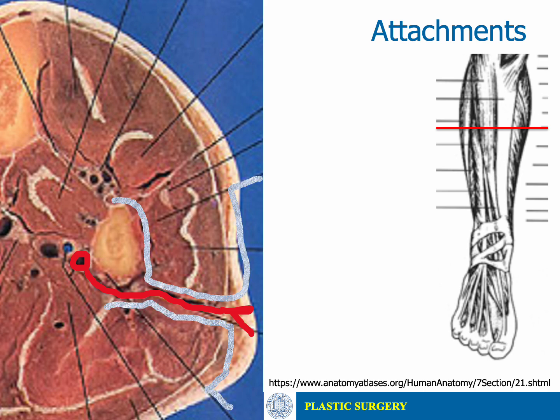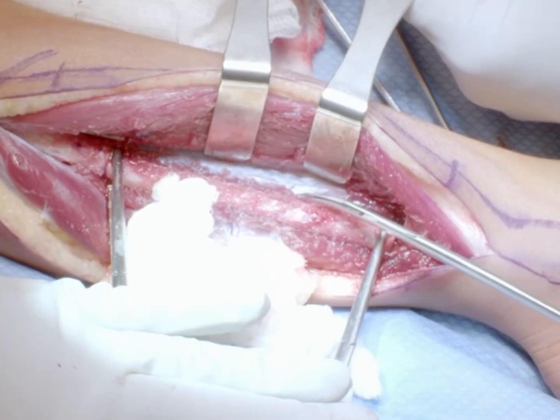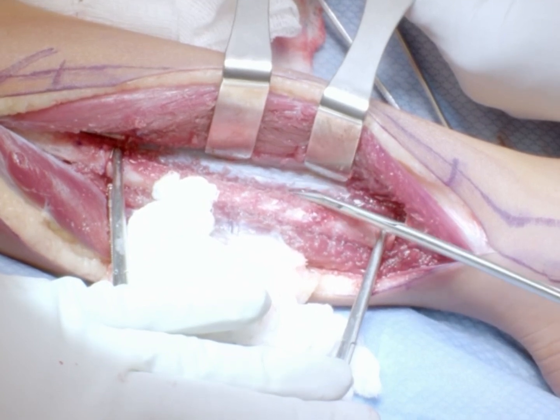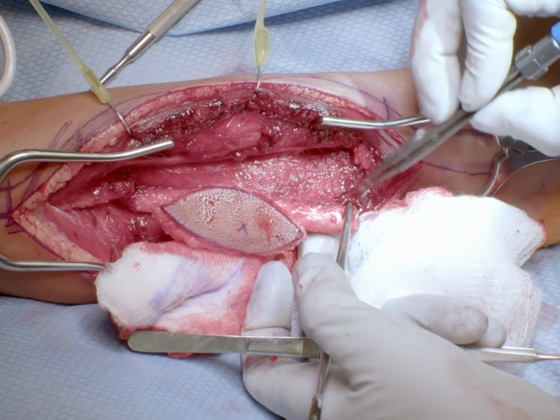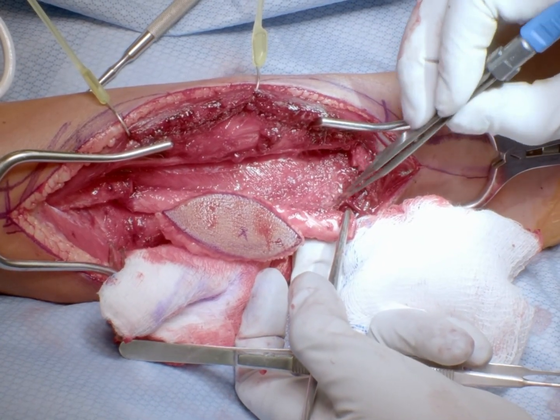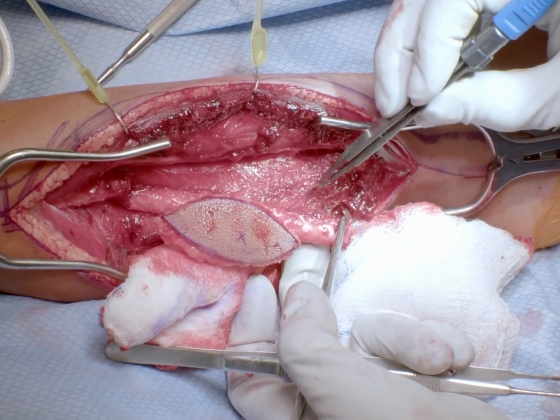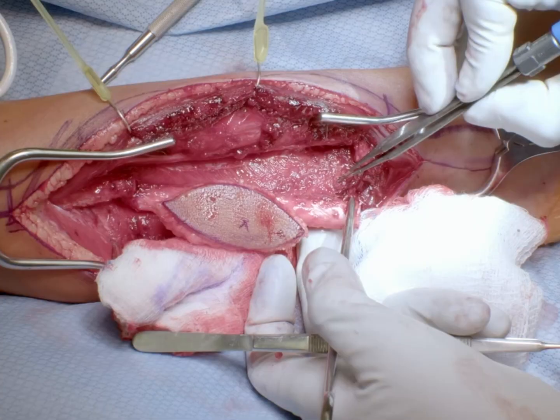At this point, the flap is only connected to the proximal peroneal artery, flexor hallucis longus, tibialis posterior, and interosseous membrane. Starting distally and proceeding proximally, the interosseous membrane is incised 1 to 2 mm away from the fibula to protect the vessels. With the interosseous membrane now open, the tibialis posterior and FHL muscles are carefully elevated off the fibula, again leaving a cuff of muscle to protect the periosteum. At the proximal termination of the FHL, the vessels will diverge from the bone and head medially to connect with the posterior tibial artery. The tibial nerve and posterior tibial artery and vein are identified medially, and care must be taken to avoid injury to these structures.